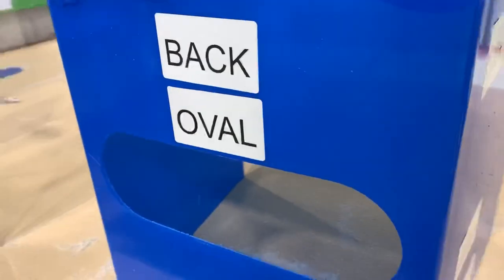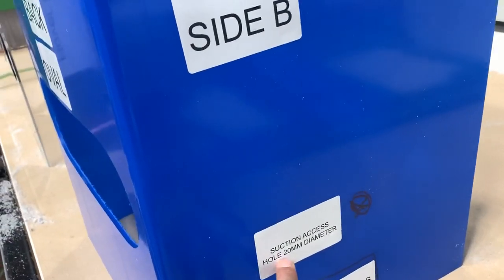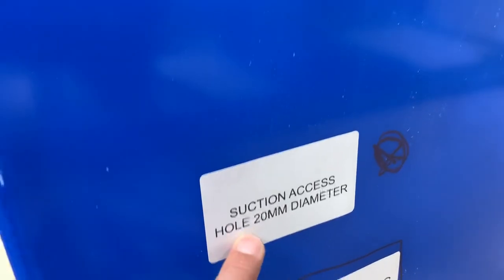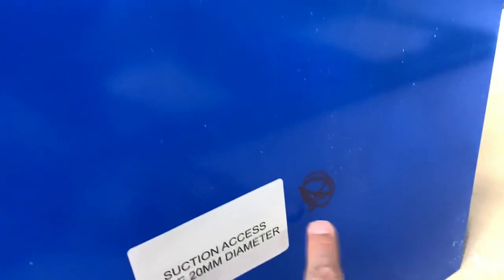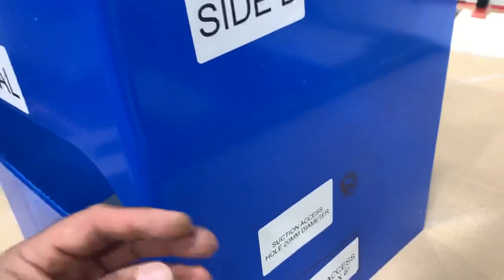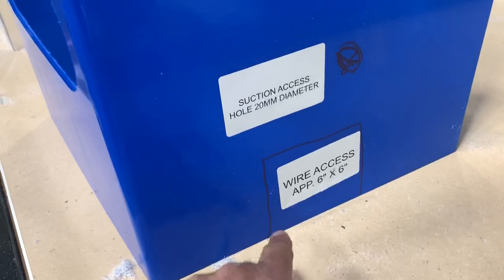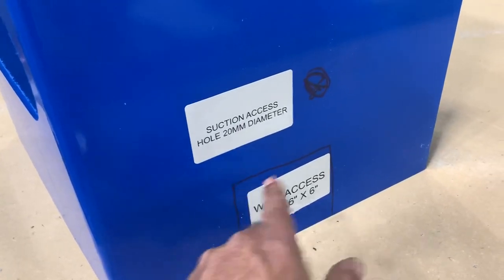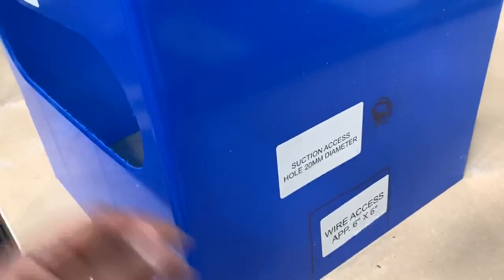Options I've seen added to it: I've seen access for a suction tube — the diameter I have is 20 millimeters, and I can locate that anywhere, probably on the side, which would give you negative pressure on the inside. The second option I've seen is a wire access for tubing, wires, or anything going into the patient.